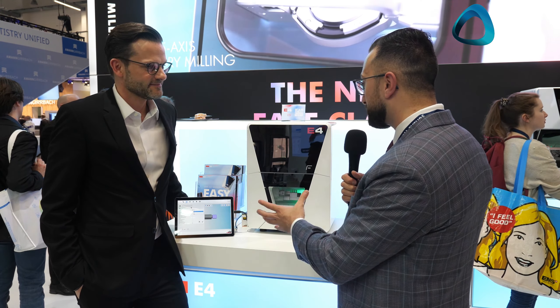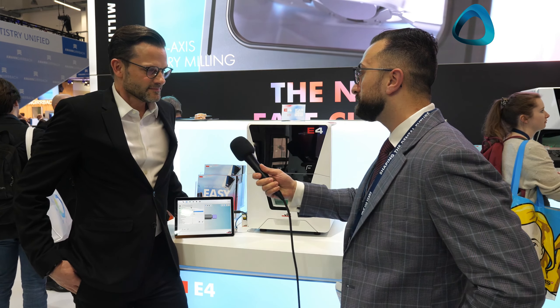It is a small footprint, as you can see. It is lightweight at just 28 kilos, so it can be shipped basically overnight from a reseller to a customer. Also, if there should be any issues in the future, it can be easily replaced. It is a wet and dry milling machine. It does not require any compressed air, which is a big plus for a dental office. And it still mills at the same premium quality that people expect from VHF.